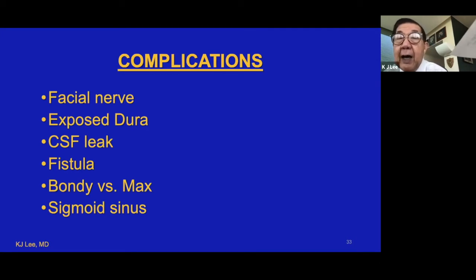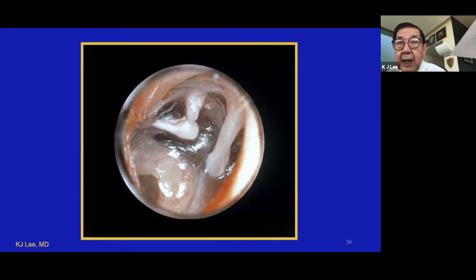Don't worry. Next. This is what we call myringostapediopexy, a type 3 tympanoplasty, where the tympanic membrane drapes over the lenticular process of the incus and the head of the stapes. If there's good aeration of the middle ear, and there is a good phase difference, P-H-A-S-E, between the round window and the oval window, this patient can have practically normal hearing, maybe a 10, 15 dB gap. So don't be a hero trying to reconstruct his ear. They're hearing well, leave them alone. Next.